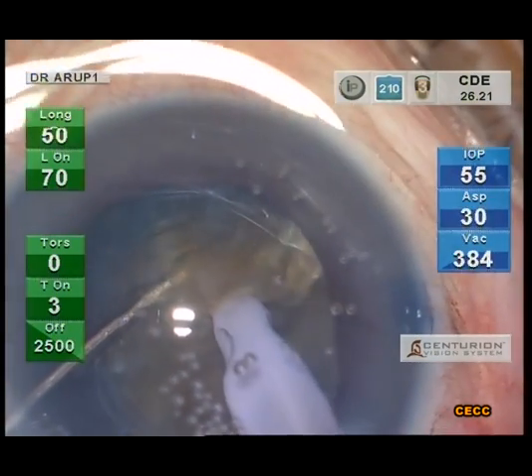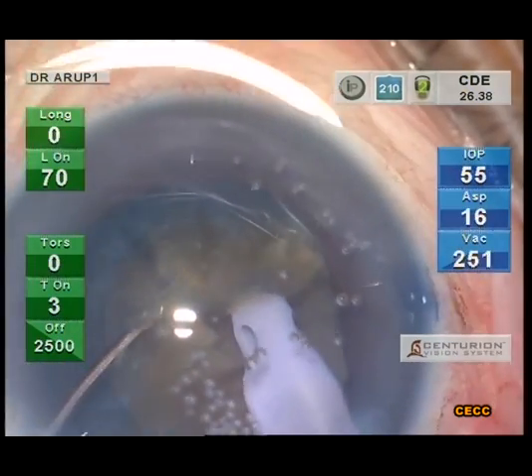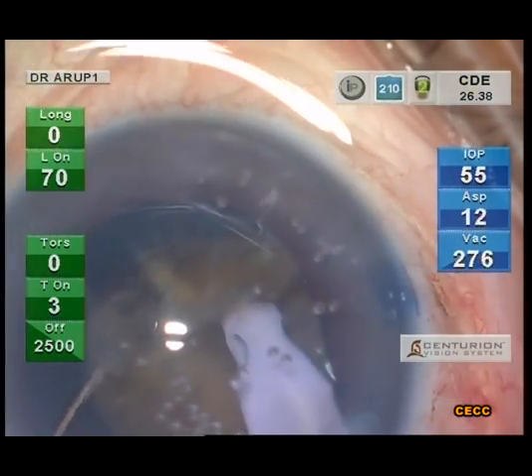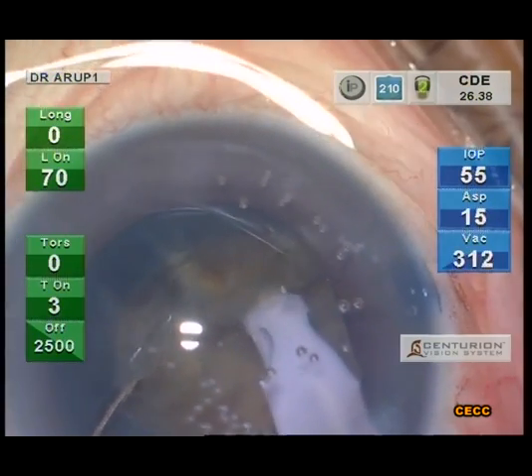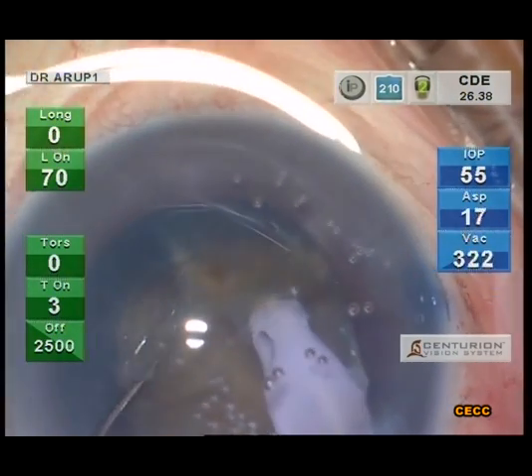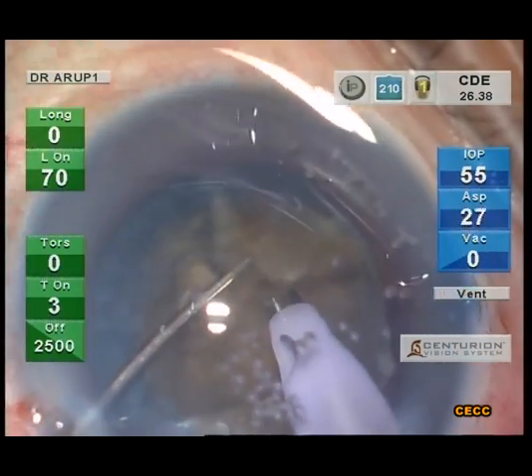Care should be taken not to distort the capsular bag and stretch the rexis margin during the chopping maneuvers. The moment a tendency to tilt is noticed, the phaco tip should be driven a bit deeper into the nucleus, and the whole process is well synchronized to produce an effective chop.